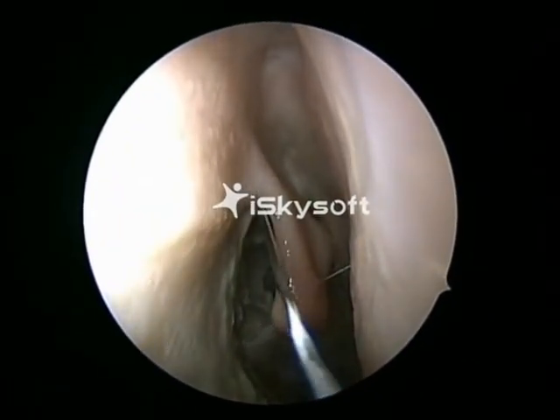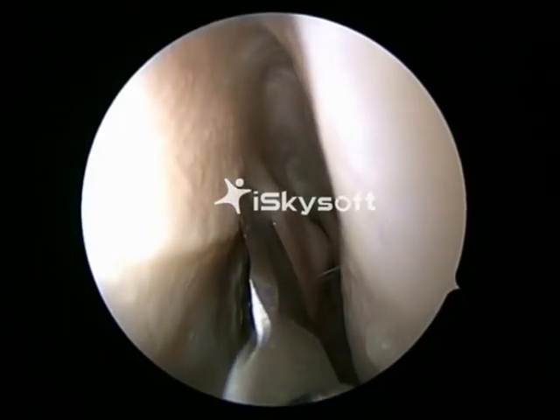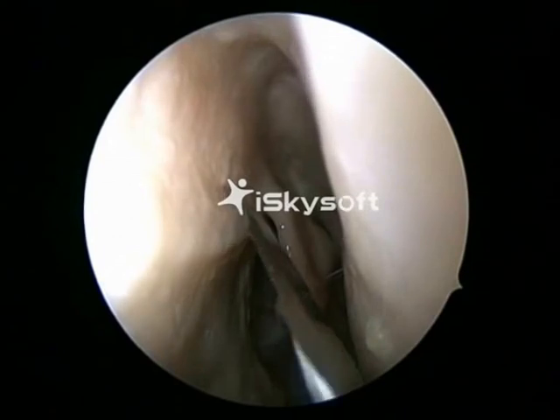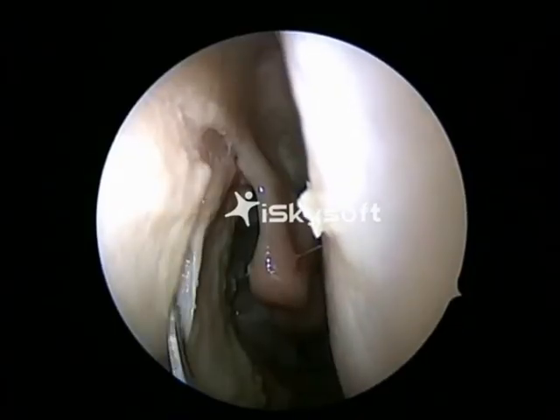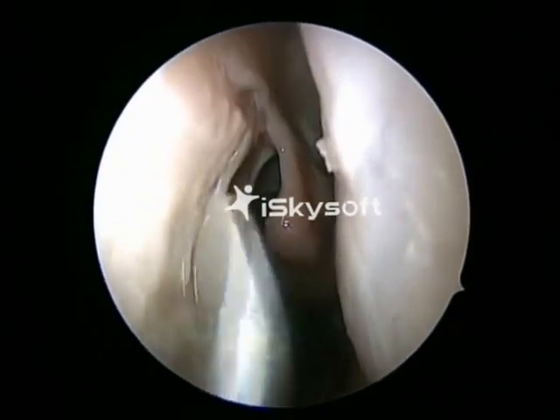The next exercise would be an endoscopic dacryocystorhinostomy. For that, we make an incision 2 millimeters above the anterior attachment of the middle turbinate, and we carry this incision 1 centimeter forwards. We then make a vertical incision.